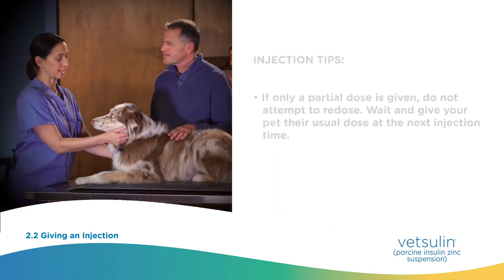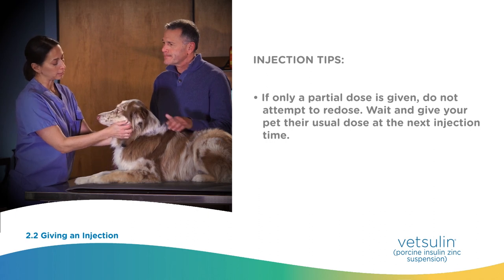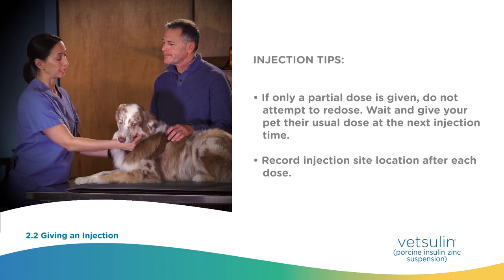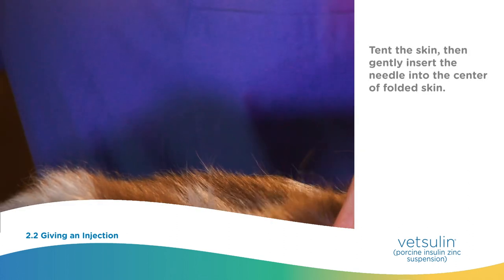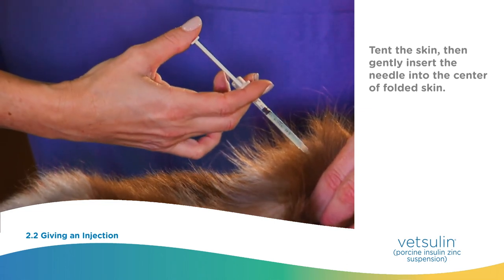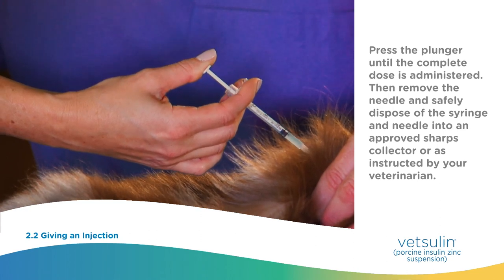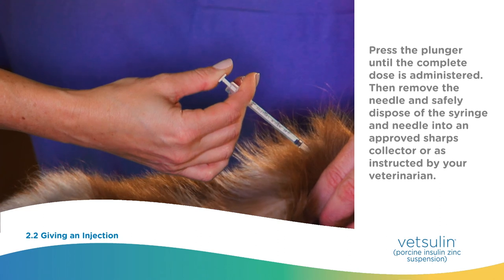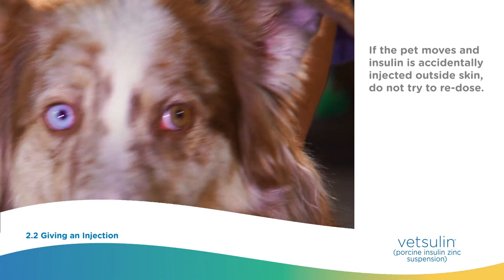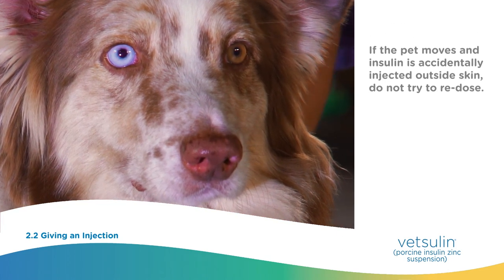Here are some injection tips. If only a partial dose is given, do not attempt to re-dose — wait and give your pet their usual dose at the next injection time. Record injection site location after each dose. Start by tenting the skin, then gently insert the needle into the center of the folded skin. Press the plunger until the complete dose is administered, then remove the needle and safely dispose of the syringe and needle into an approved sharps collector or as instructed by your veterinarian. If the pet moves and insulin is accidentally injected outside the skin, do not try to re-dose.